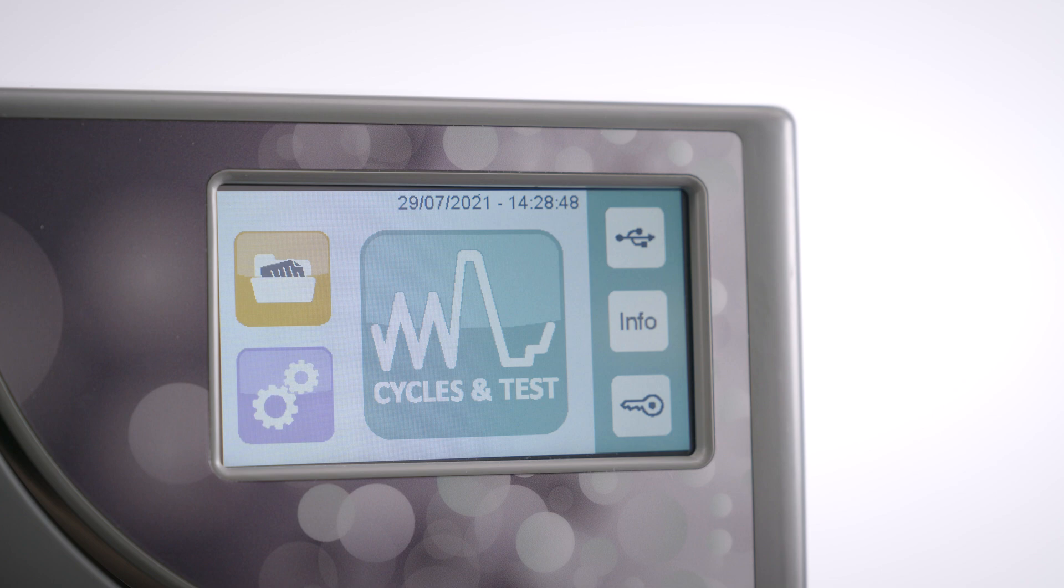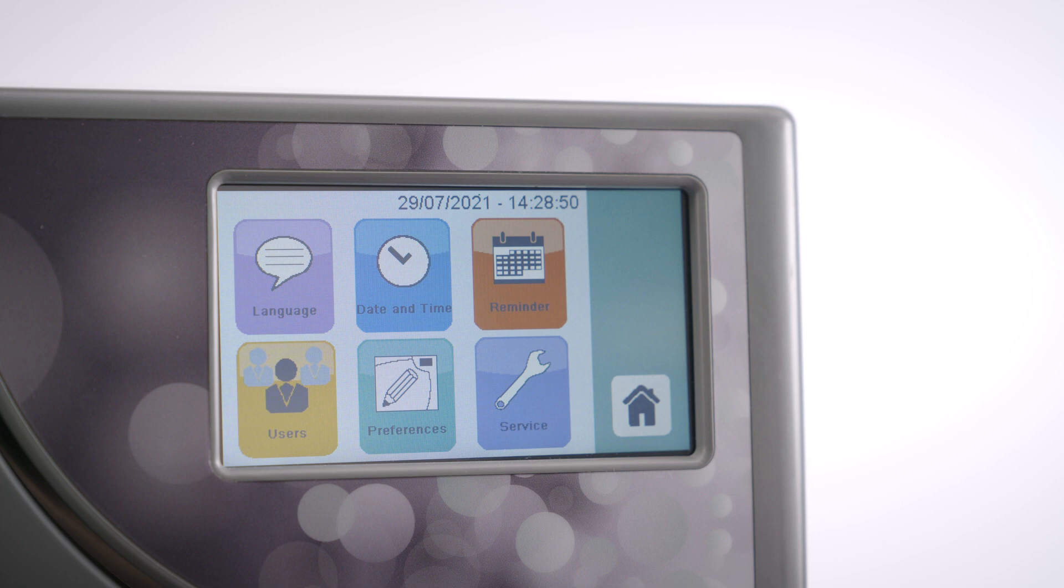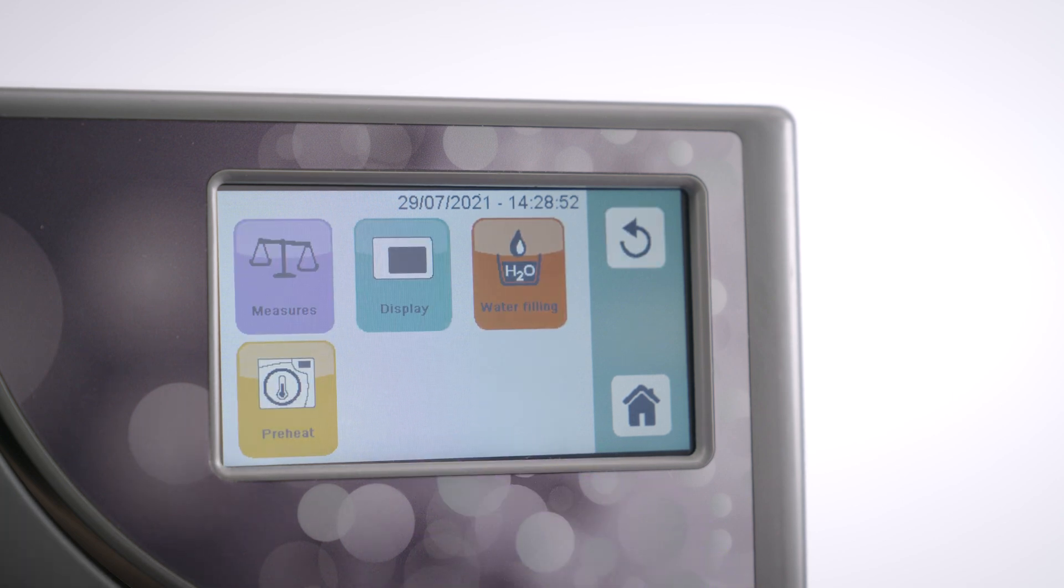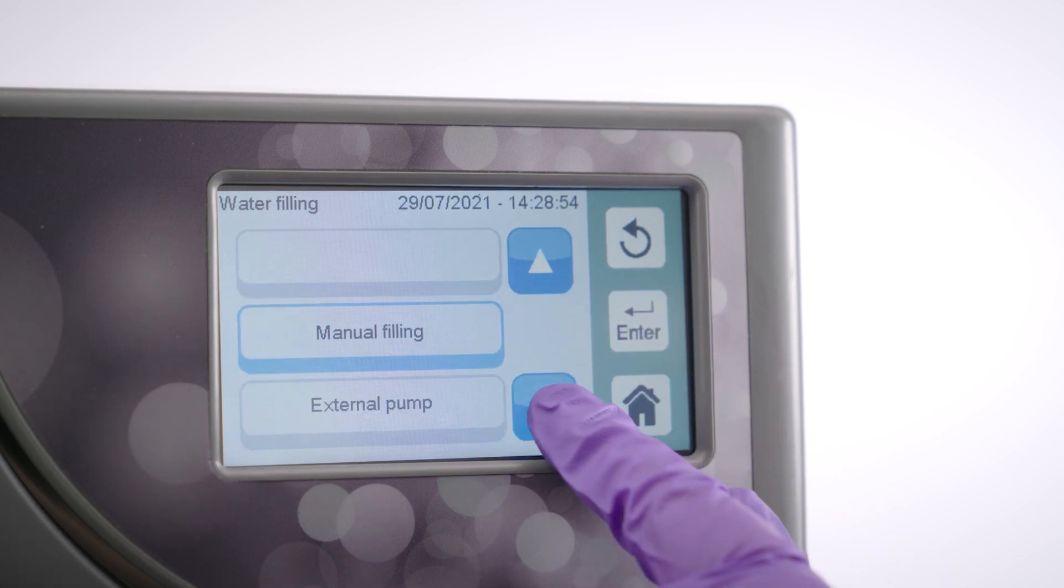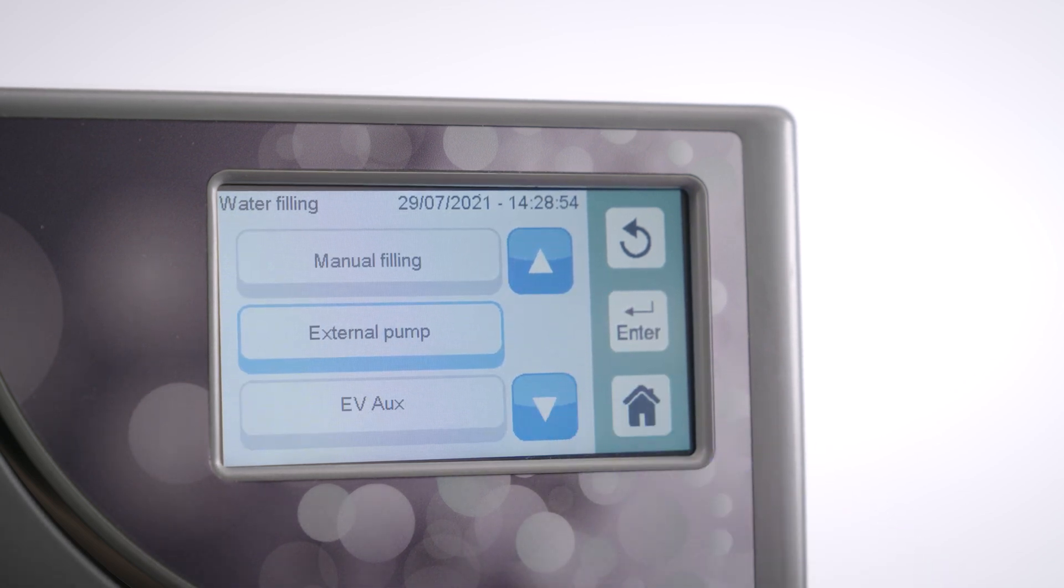Follow these simple steps to select the correct water filling setting. Select the settings icon, followed by preferences. Select the water filling icon, which will bring you to a list of manual and automatic filling options.